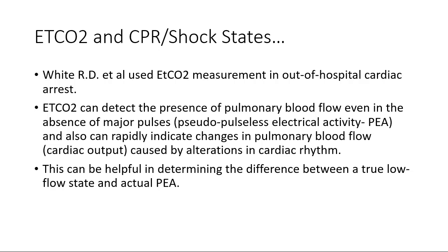So what does that inform you? Does that mean you rush out to the ambulance? No. It means you stop what you're doing and you get ready to work the code again right there, so there's no break in perfusion. It means you stop and reset to work a code instead of a post-ROSC. So this is also useful in telling the difference: are they truly PEA or just a low flow state? Because that can change your treatment plan, stuff like that.